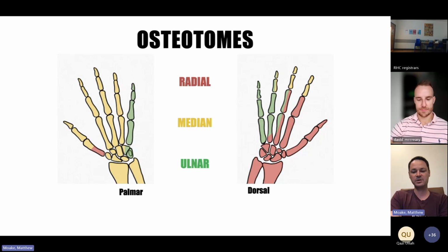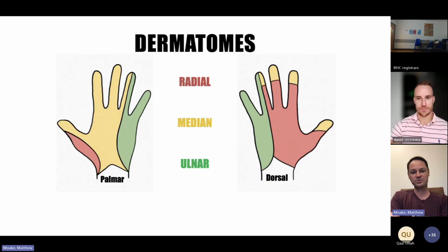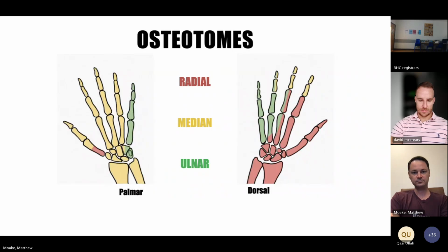The other key I always point out to people is that while dermatomes, which we all learn in our classic anatomy textbooks, have these nice demarcated lines, I find very rarely is there a procedure where only one nerve in the forearm is going to be adequate, because there's cross innervation among dermatomes. And so usually I'm going to block the area that is the most focal and then probably one of the other adjoining nerves, anticipating there's going to be some cross innervation there.